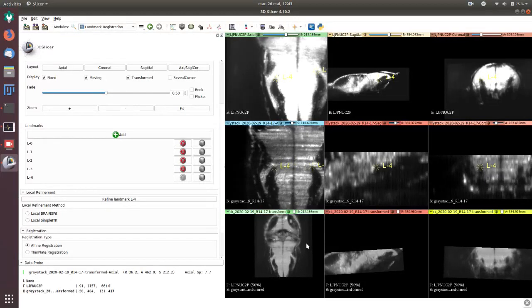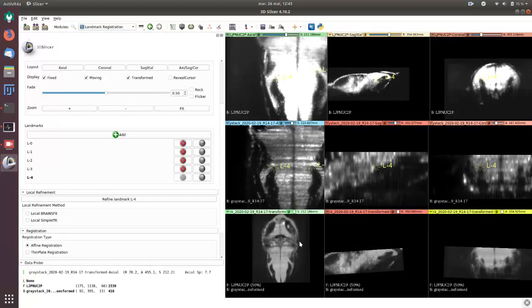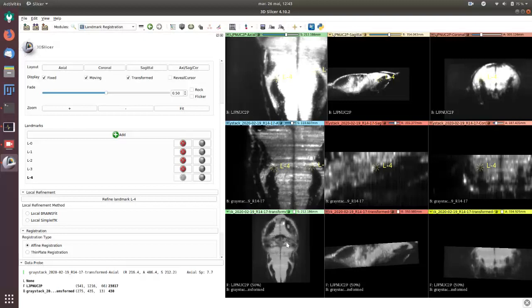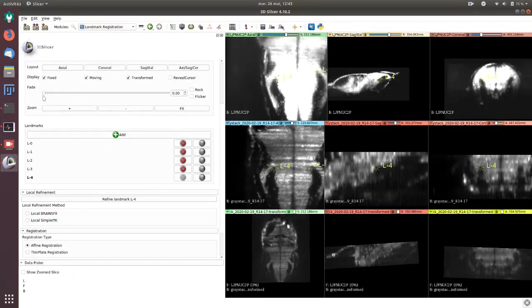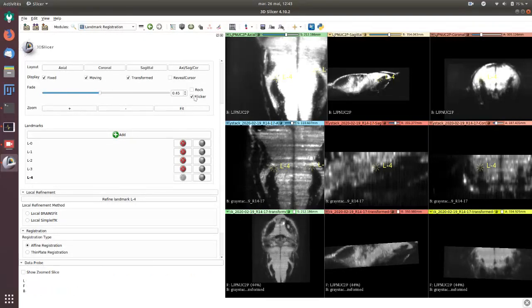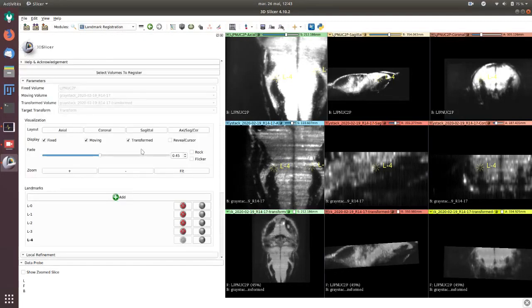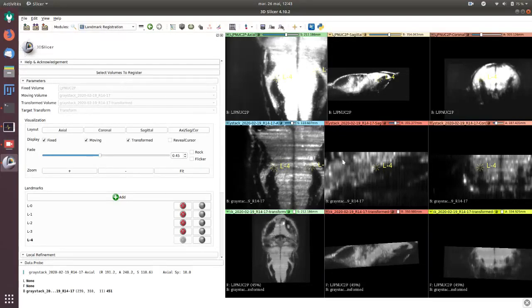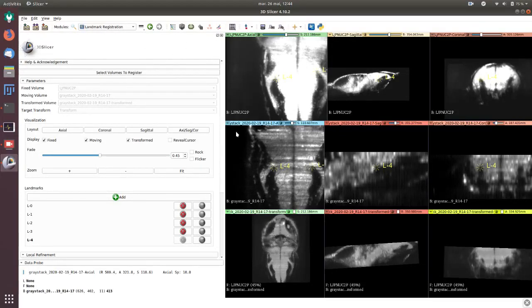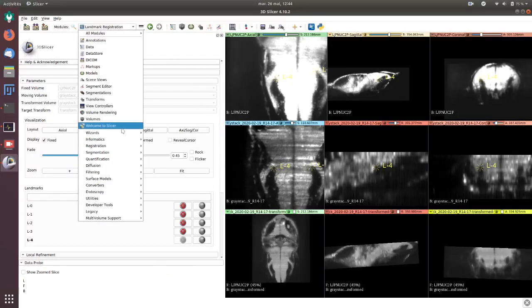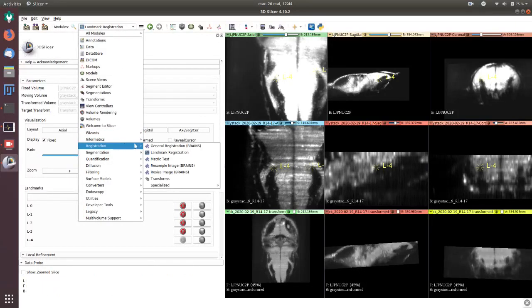Okay, so let's say I'm okay with the results. I can manually drag to see, I can flicker between two positions. So I want to export the output results to see, for example with ImageJ, if it's okay. I go to registration and resample.